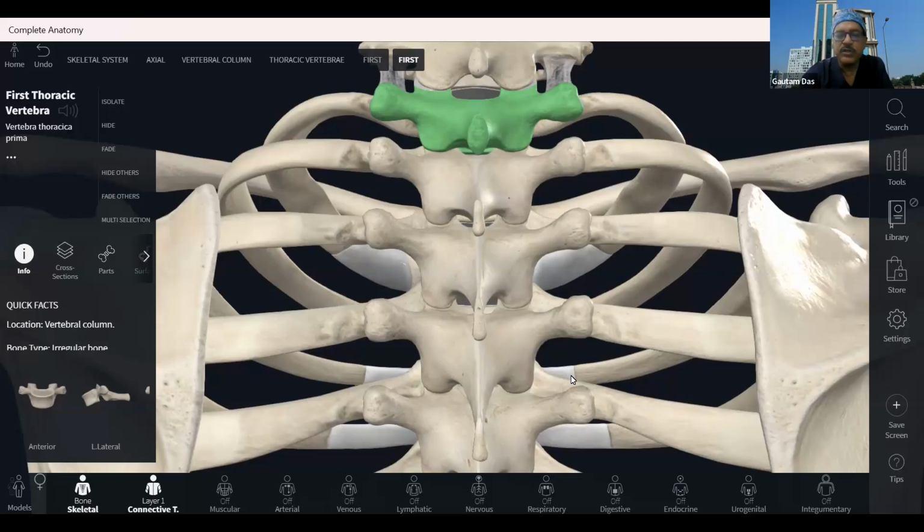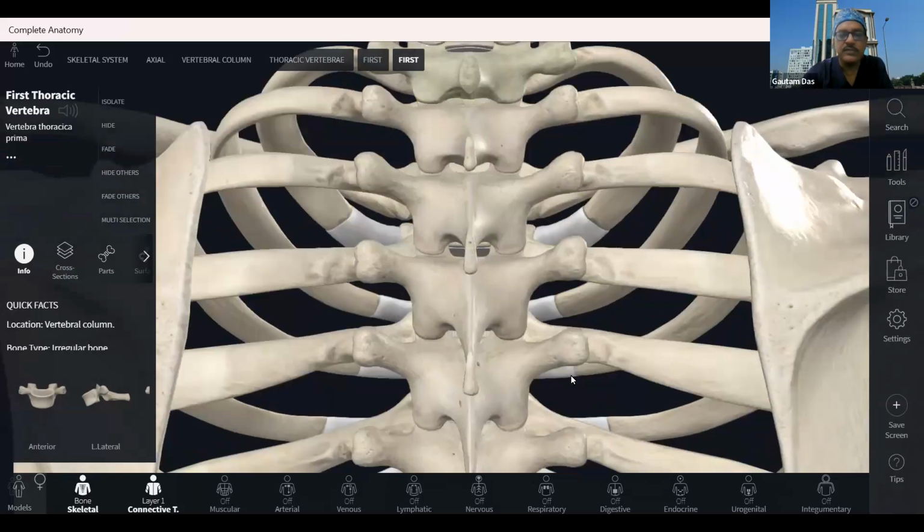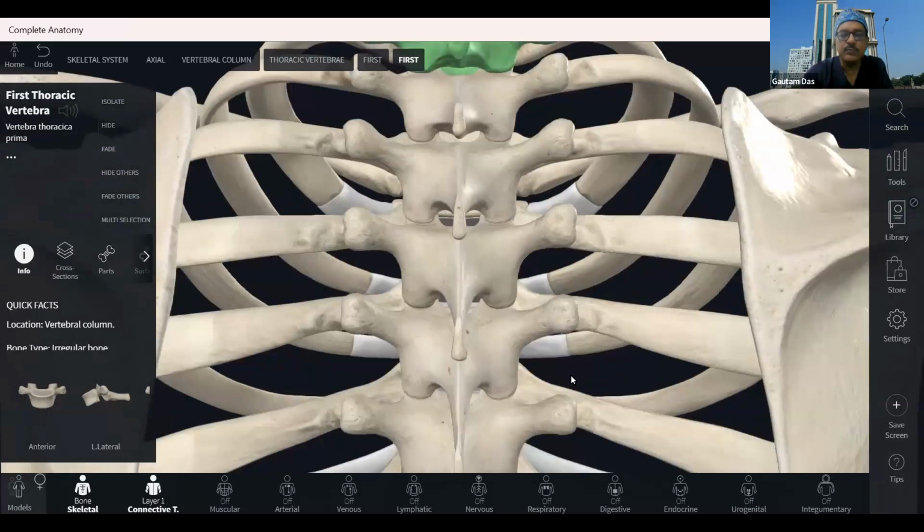Facet joint area and interlaminar area sometimes might be confusing. The interlaminar area might have more gap, but it may not be shown in the lower area. Maybe the gap is almost similar. So if it is asked where to inject for your facet area, the best thing is to slide the probe more lateral. As soon as you see the lateral edge and soft tissue coming, go back to the earlier place and go for the injection there.